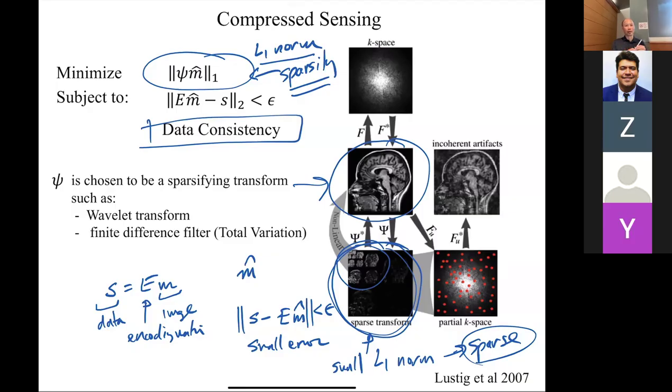That's like language, right? So the idea is each word you can think of as a basis function. Everyone know what a basis function is? Or a basis vector? Okay. So essentially, like what we were talking about in Fourier domain, every sinusoid is a basis vector, right?